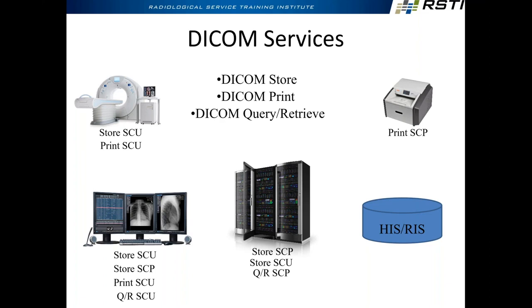But based on this scenario that you see right here, there would be no way to get an image from here to here. How come? Based on what you see here, if you delete an image from here, there'd be no way to get it from the PACS or the workstation back to the CT. Because it's not a provider. It's only a user. Again, a lot of them will have the capability, but I'm just saying based on this exact scenario.